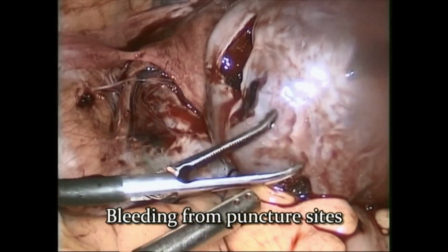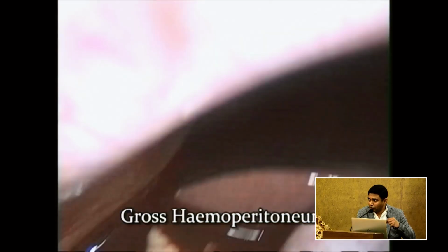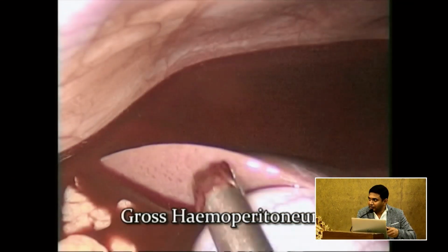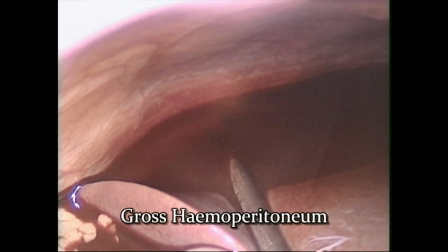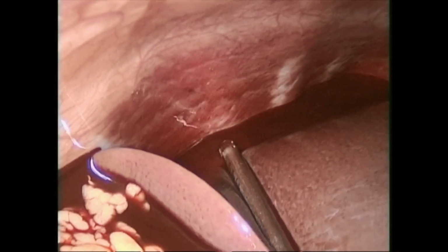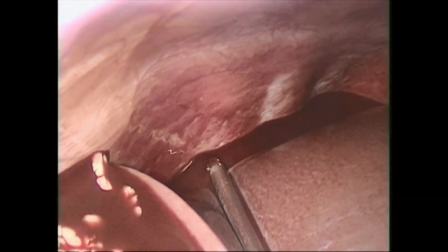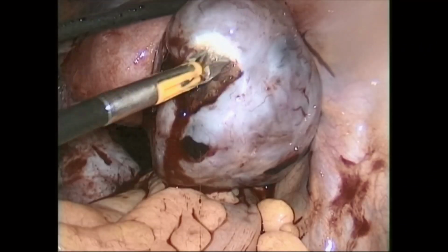So the simple technique which should be followed is, you need to coagulate in such a manner that the blood coming out of the ovary is coagulated, and it forms a crust over that raw area, which helps you seal it. You can appreciate the gross hemorrhage post oocyte retrieval.